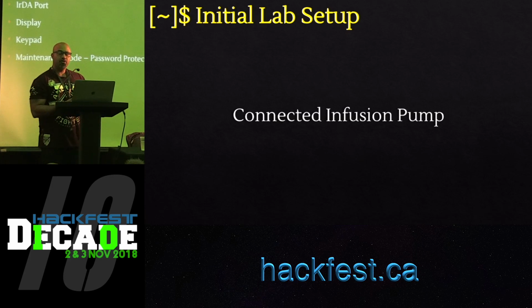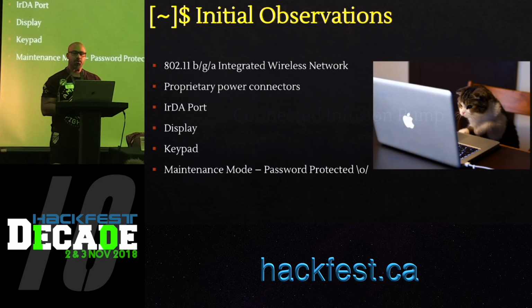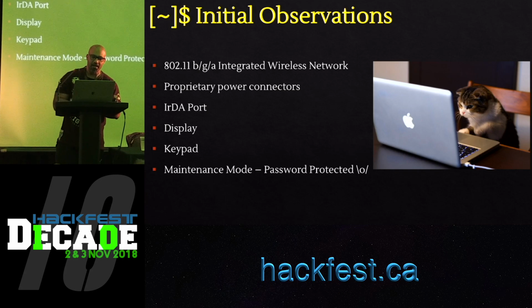As soon as we found out about the maintenance mode, we frantically started Googling to see if there's some sort of manufacturer's guide out there which might expose the default password. And surely there was. So we got the default password, and we tried that password on. And of course it worked, because you have no idea how much effort goes into changing the default passwords. It's just madness.